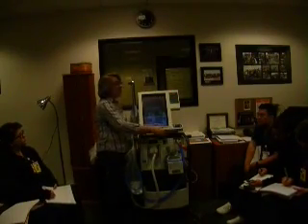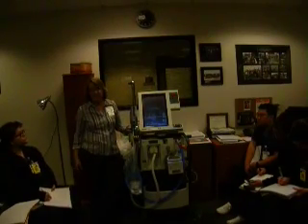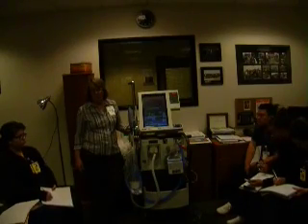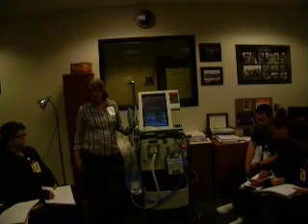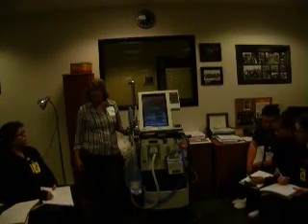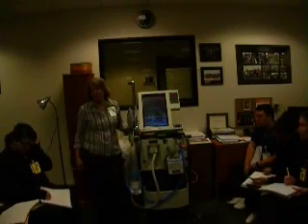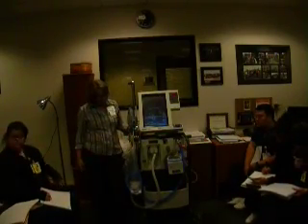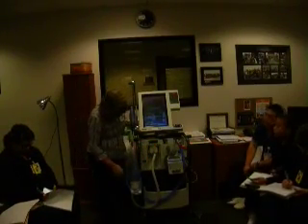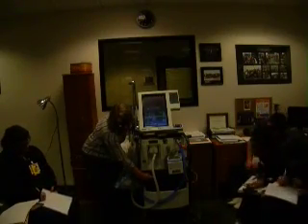Then expiratory pause and inspiratory pause, we will use those when we calculate and learn how to do compliance and resistance, which I'm not going to do today, I just want you to know where they are. When I teach you about compliance and resistance, I'm going to tell you that you need to do a breath hold on your patient to get a plateau pressure. I'm talking about doing an inspiratory pause, and that's where your button is. Okay? Like I said, your filter's down here. This is your battery indicator down here, which tells you if it's charging or not, down here at the bottom.